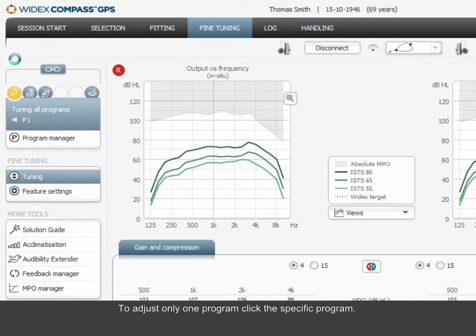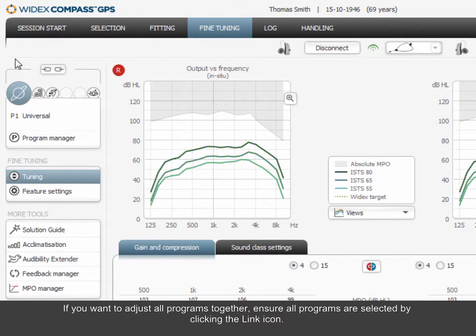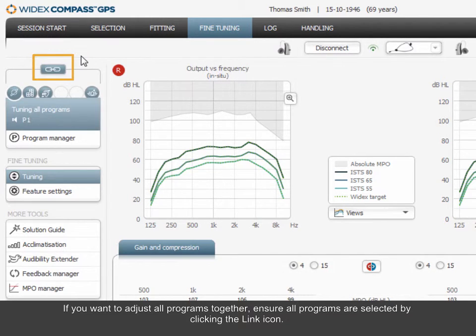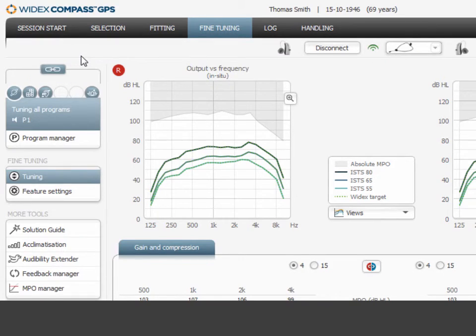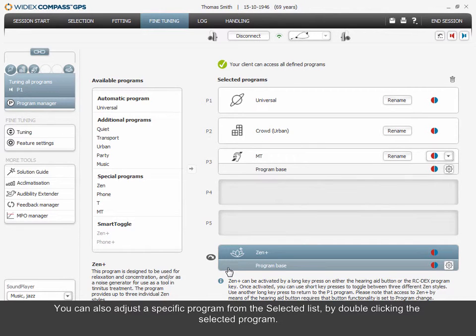If you want to adjust all programs together, ensure all programs are selected by clicking the link icon. You can also adjust a specific program from the selected list by double-clicking the selected program.